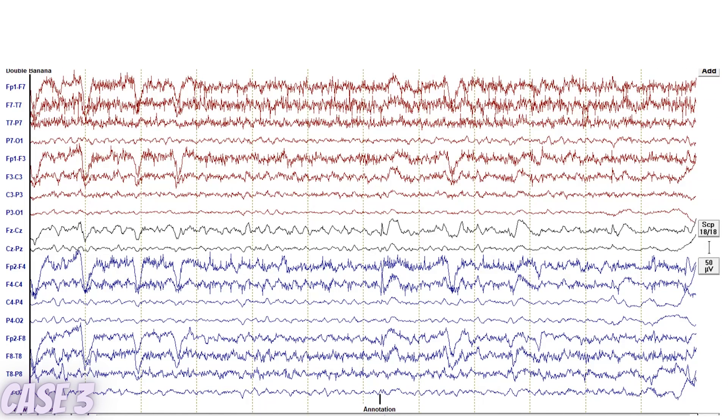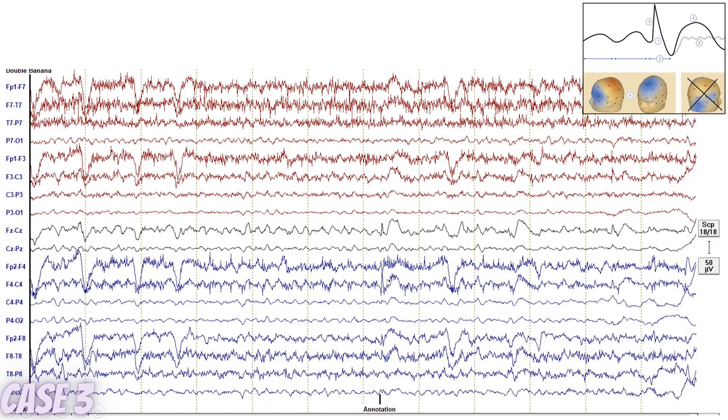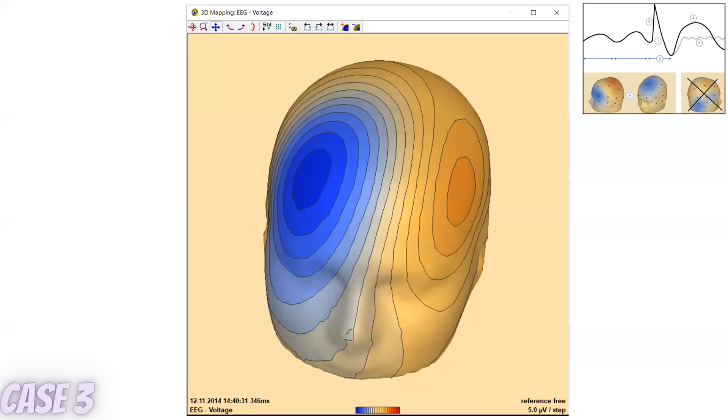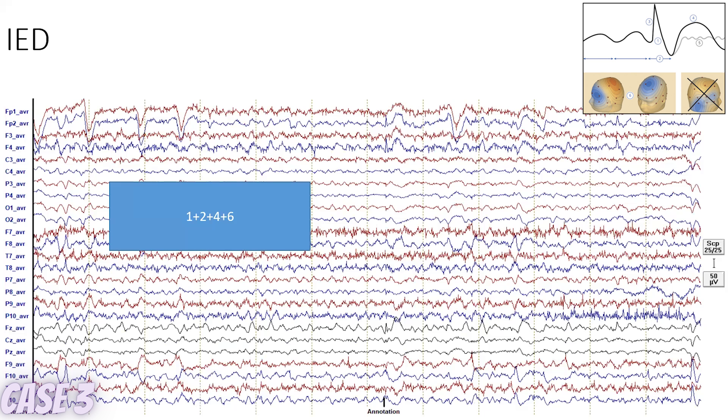Let's see another. Oh, there you go. This is a little bit more noisy, but that's real world, real life. This one? Yeah, this is spiky, number one. I think its duration is different from anything else in the background, so two. Asymmetry - I think to me it looks, well it depends on how you measure it, but I think its slope is steeper going up maybe, but I'm not confident about that. That's always a matter of discussion. And then it has a slow wave, I think. Let's see, is it right after? I think so, but it looks like it has a little bit of oscillation in the background. But the background is very noisy. So I'm going to give it a yes for that. Here's your voltage map, and a yes for that then.